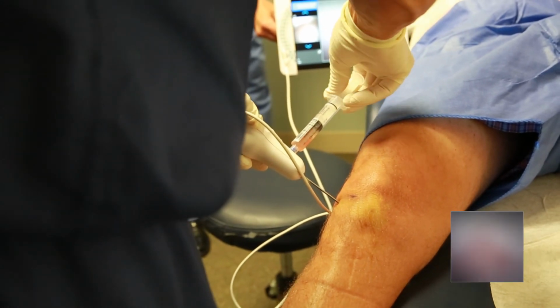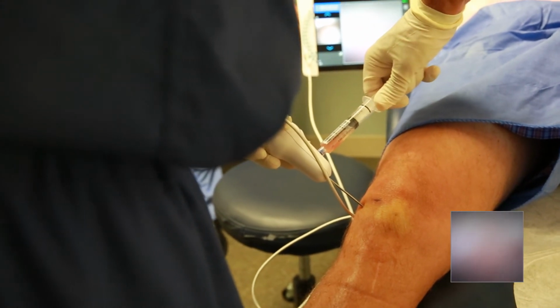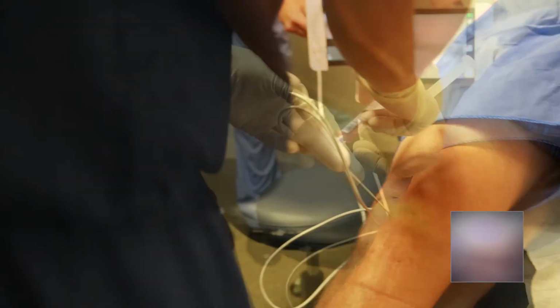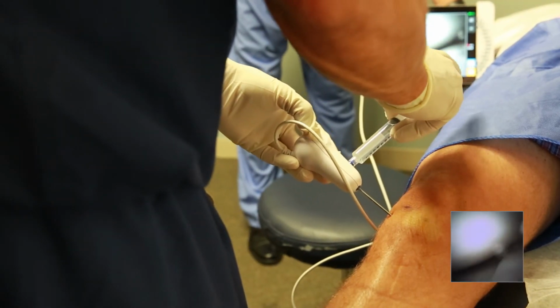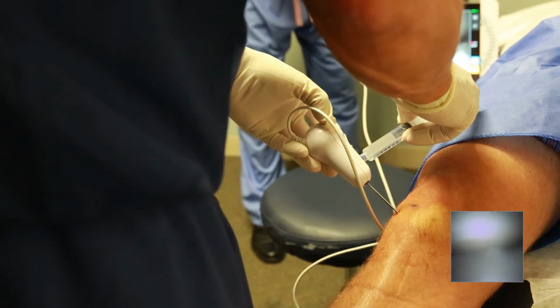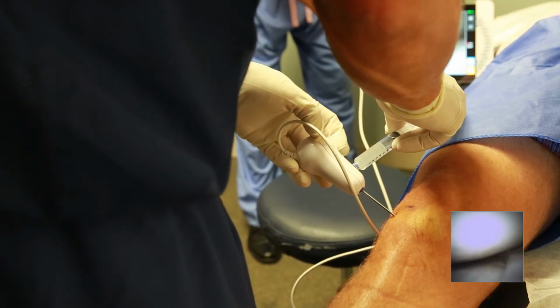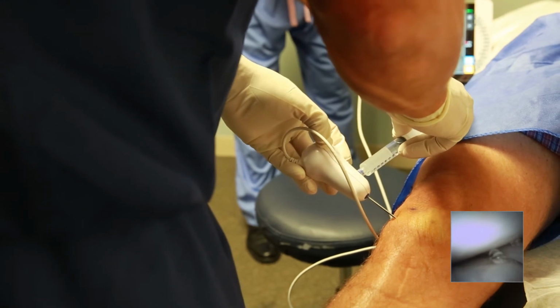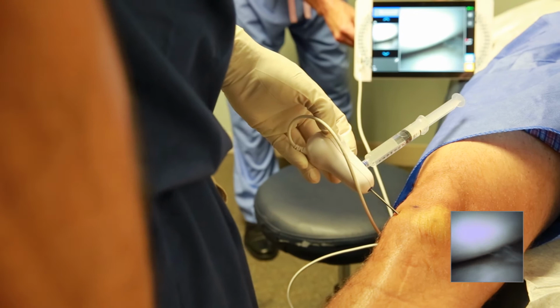Your medial side. Now we'll suck some of this fluid out. There's where we had a meniscectomy. Did they fix your meniscus, Jason, or did they take it out? They probably took it out. It was 30, well, it was a long time ago. 20-something.